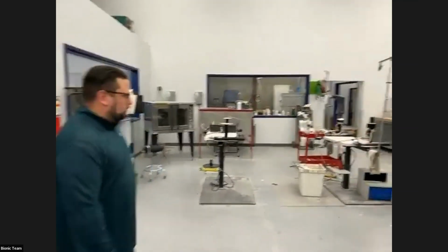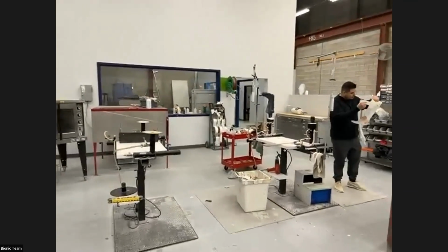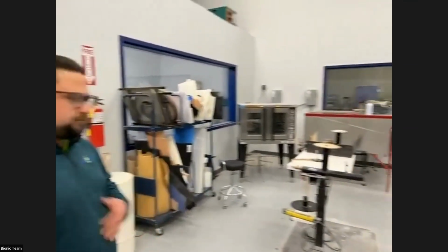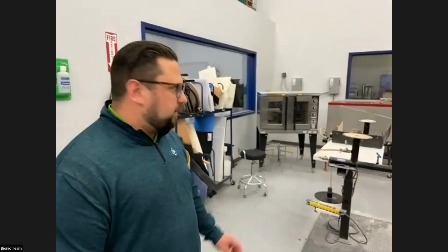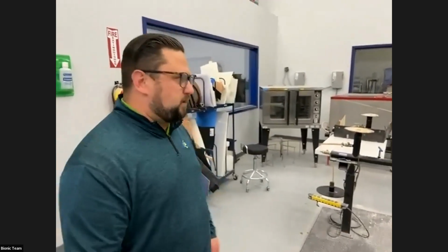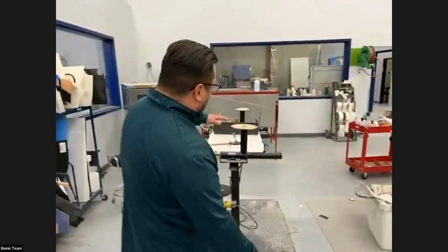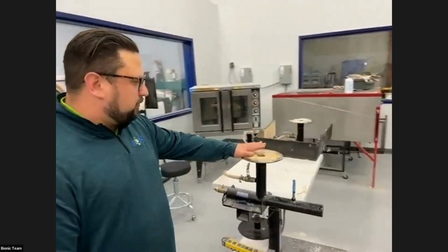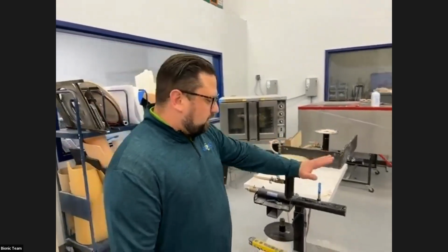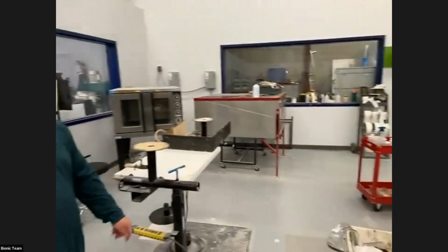Going to walk over to more of our thermal forming and second set of lamination stations. Because we utilize so much printing, we really only need 2 ovens going at any time. We have a standard convection oven that we primarily use for foams and diagnostic sockets. And then we have a larger PDQ oven, which we utilize for more of the orthotics or larger plastic pieces that we need to pull. These also are our thermoforming stations where we can bubble form diagnostic sockets or flexible inners, as well as standard orthotic thermoforming.